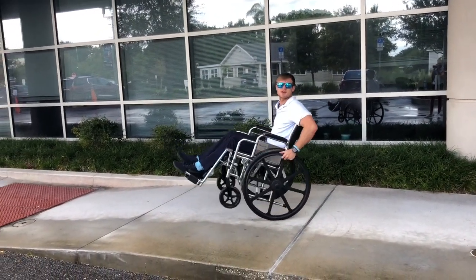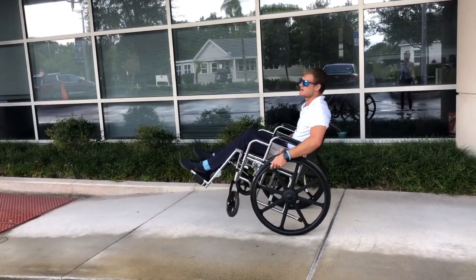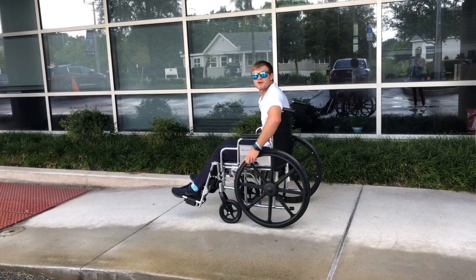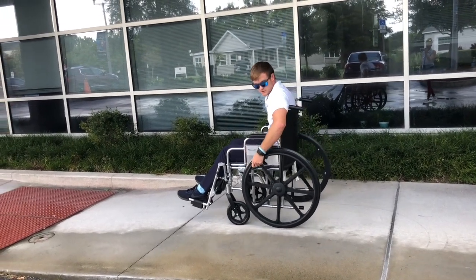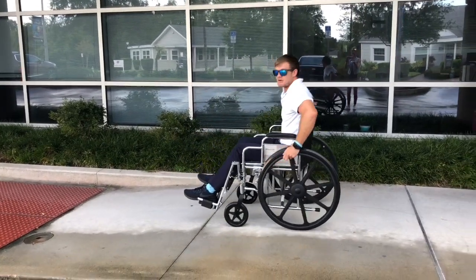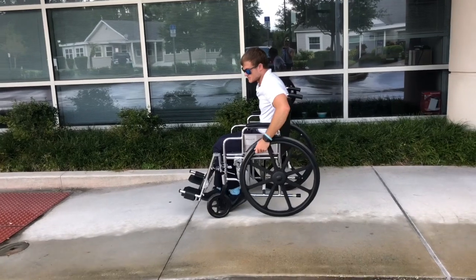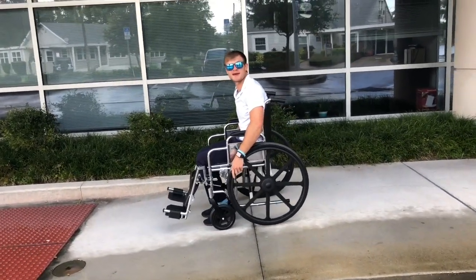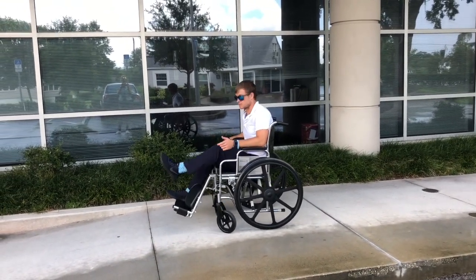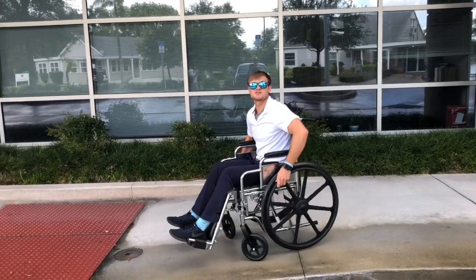You guys made it outside — let's be on time next time. Now we're going to go down an incline. There are a couple of ways to do this. You can hold on to the push rim, and depending on how tight your grip is, that controls your speed going down — looser grip means faster, tighter grip means slower. Another way is to use your feet as you go down, which is useful for a steeper slope to control momentum. You can also zigzag down a steep slope — start right, then go left — and that helps control momentum going down.